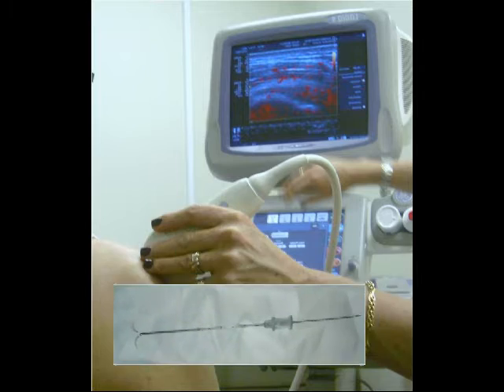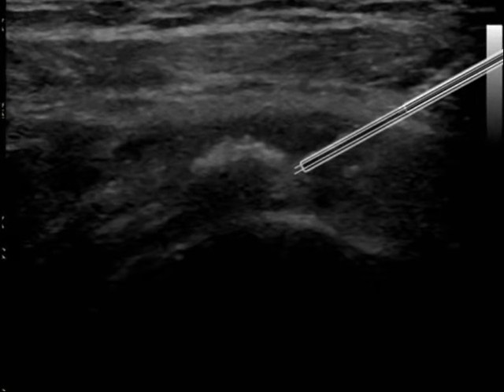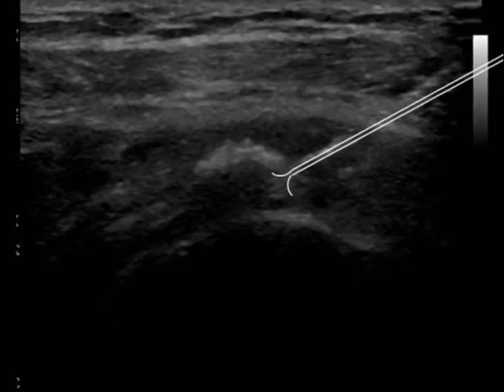After an interscalene block and under sterile conditions, we can use ultrasound to put a breast biopsy needle into that calcific material. This is very helpful for identifying where it is.